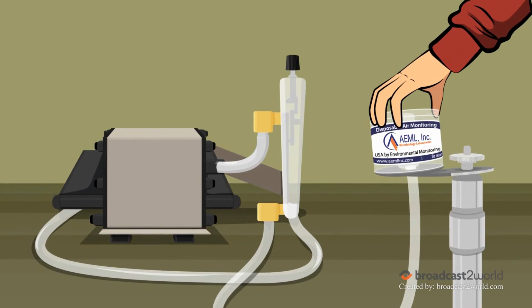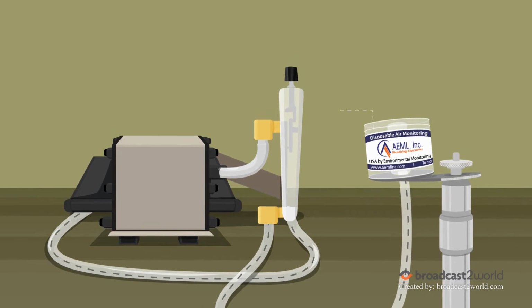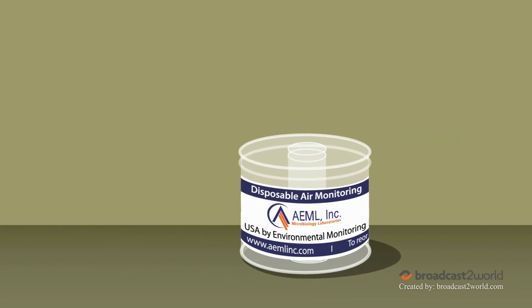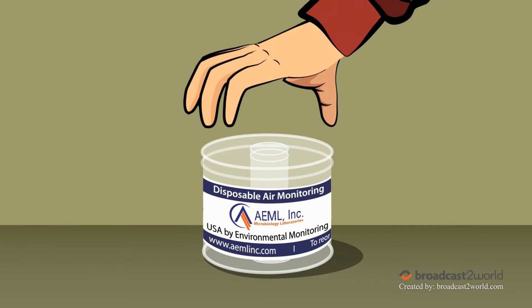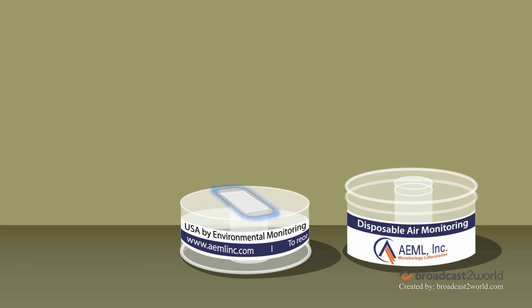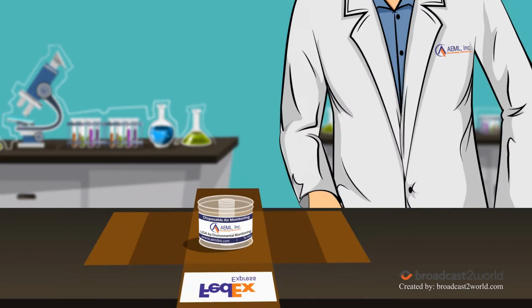Spore traps work by drawing in air to collect airborne bioaerosols, including fungi, pollen, and particulates. As the air is drawn in, any airborne bioaerosols present are impacted on a sticky glass slide inside the spore trap. This forms a pattern on the slide referred to as the trace. The samples are then transported to the lab for analysis.